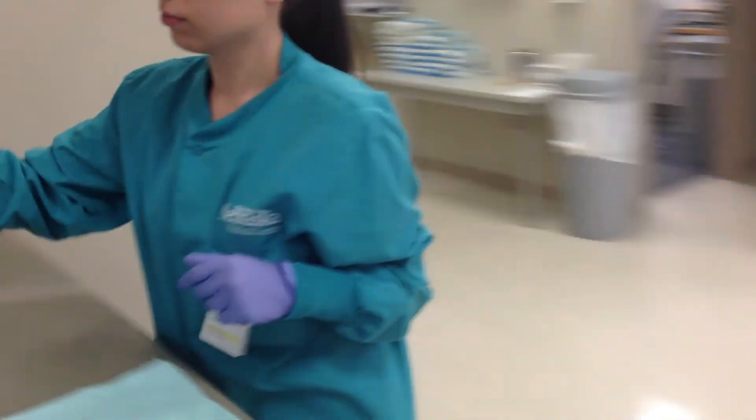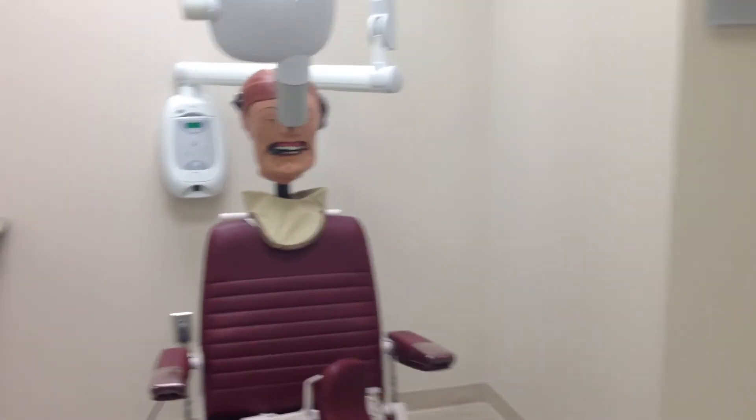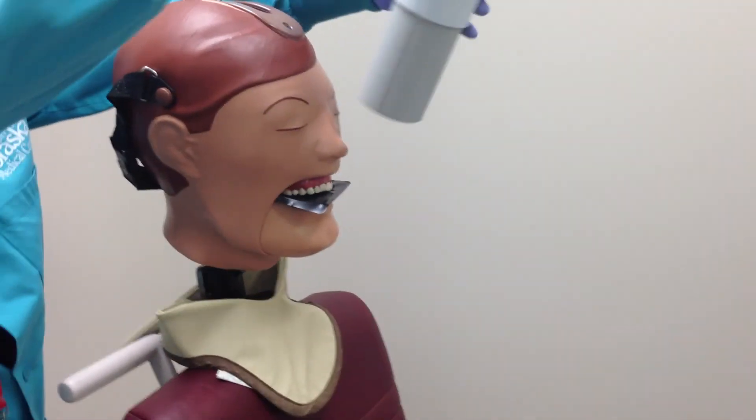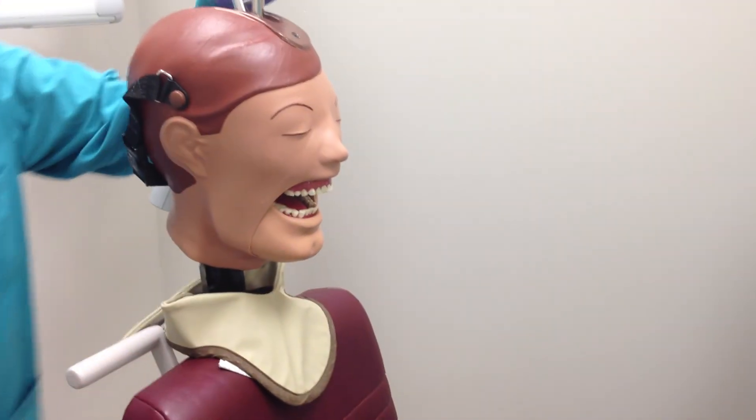Now you are ready to push the exposure switch. Remember to hold it down the whole time. And once done, you can remove the plate from the patient's mouth. Remember, all occlusal radiographs use the extreme bisecting angle technique, which results in more distortion and shortening of the teeth.